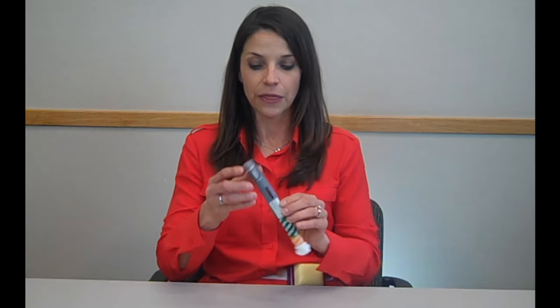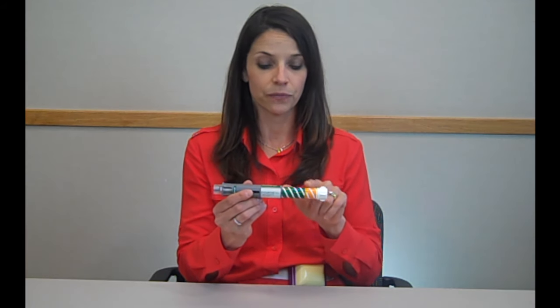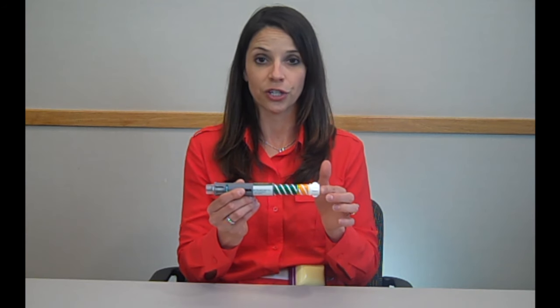Hi, I'm Jen and I'm a pharmacist. Today we're going to talk about your Bidurian pen. This pen has several different parts: it has the cover, the needle, the mixing well, inspection window, your green label, striped label, orange label, and the injection button.